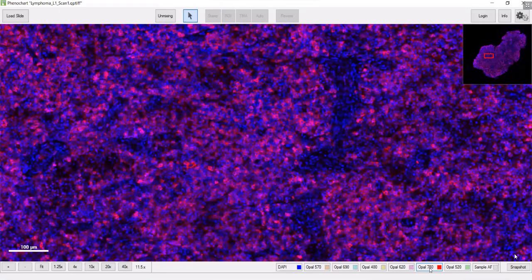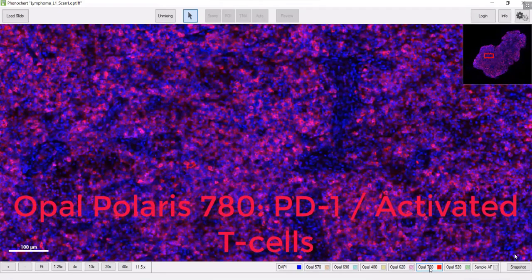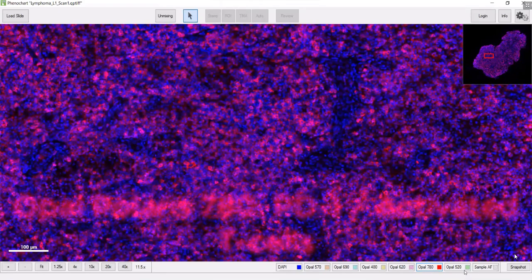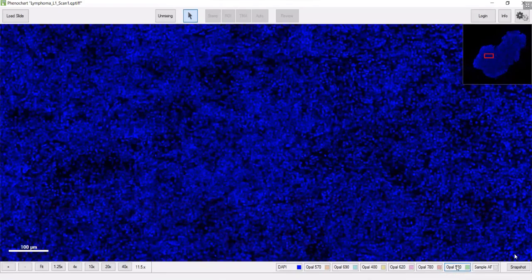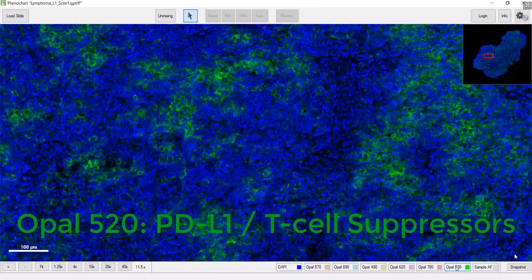And then we have the PD1 marker and the PD-L1 marker.